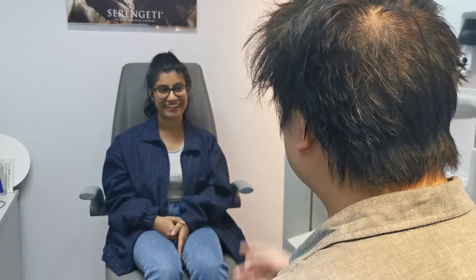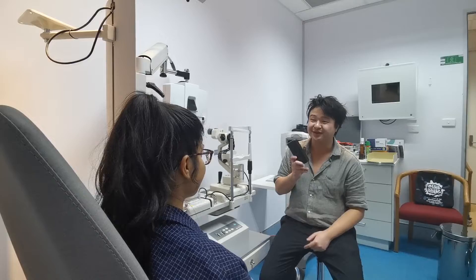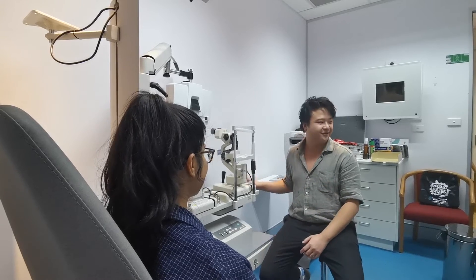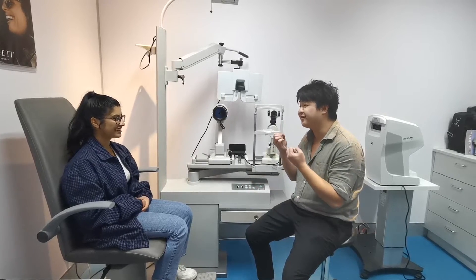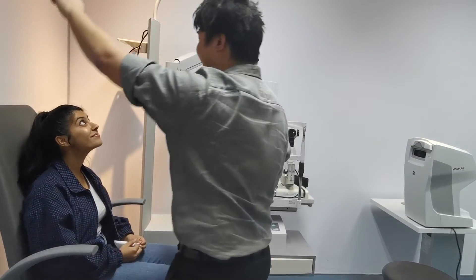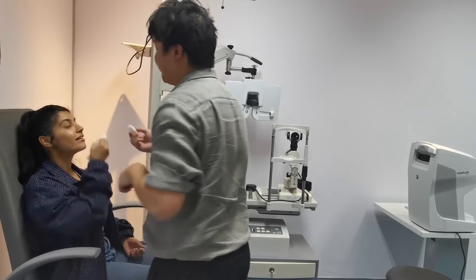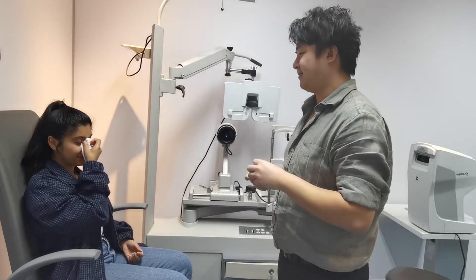If you find any of these clinical findings and would like to proceed with gonioscopy, let your patient know. I usually explain it in lay terms and say something along the lines of: 'I would like to do some further examination with a diagnostic lens on your eye. The procedure roughly takes about a minute. Would that be okay?' Once you get informed consent, let the patient know you'll be using some anesthetic eye drops. Let them know how to minimize side effects with the double dot technique or forceful closure of their eyes, and make sure to check for contraindications before installation.